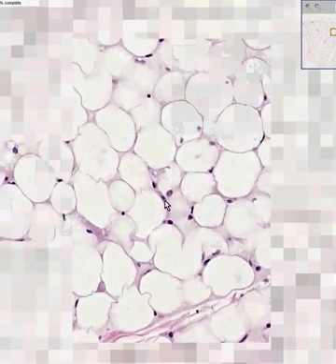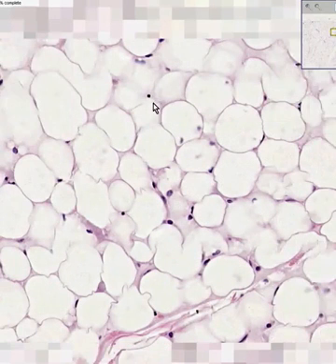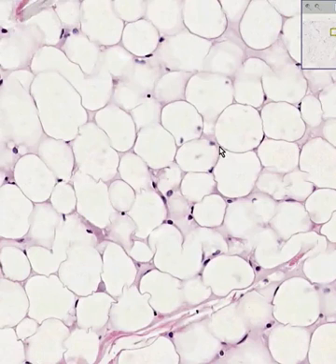Because of that, the nuclei of these adipocytes is classically a little bit spindly and pushed off towards the side, and sometimes you'll be lucky enough to see little blood vessels or little capillaries, like perhaps here, like certainly here, in which you can see the blood traveling within the septae as well.